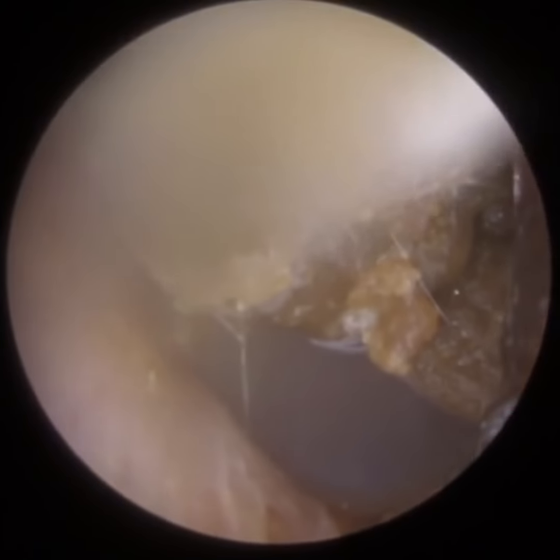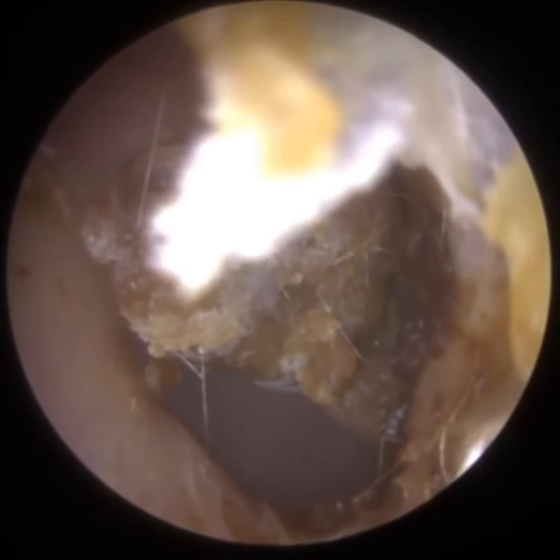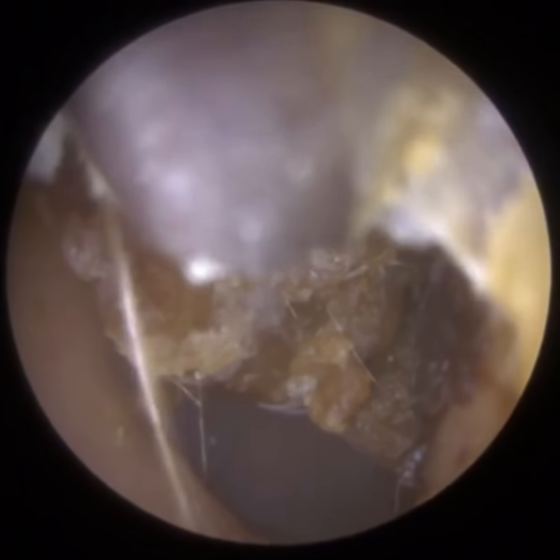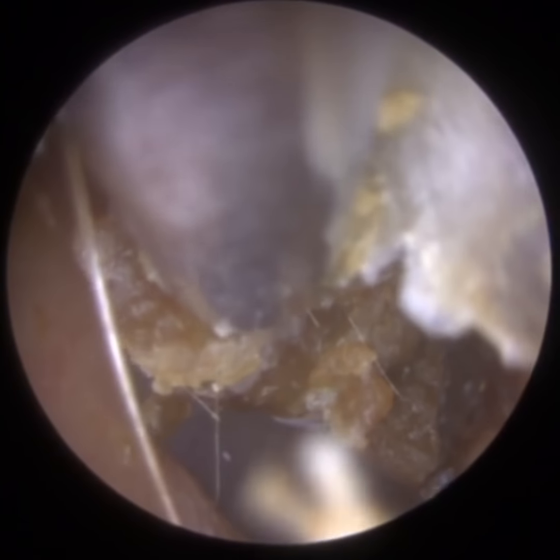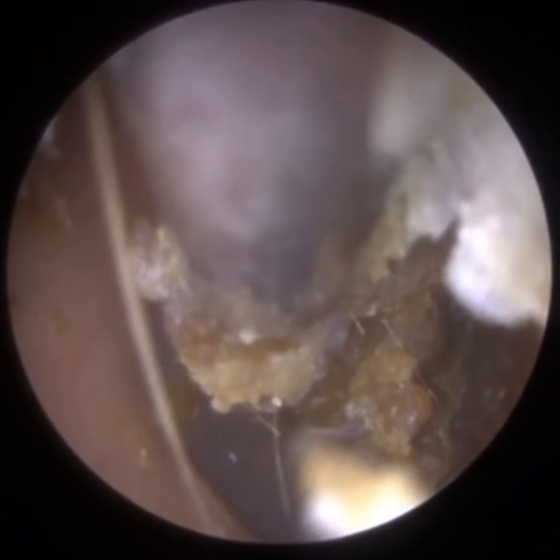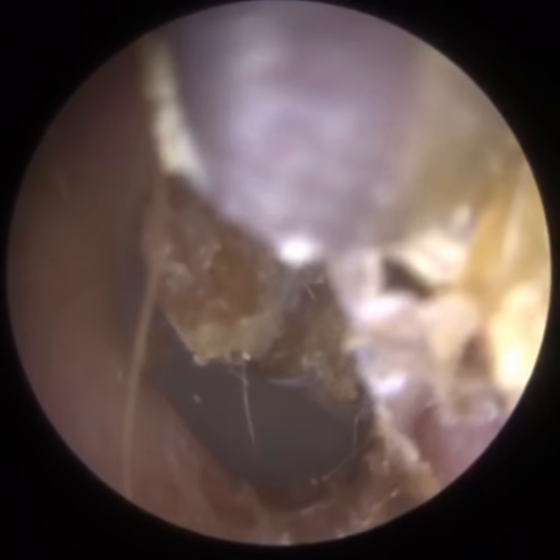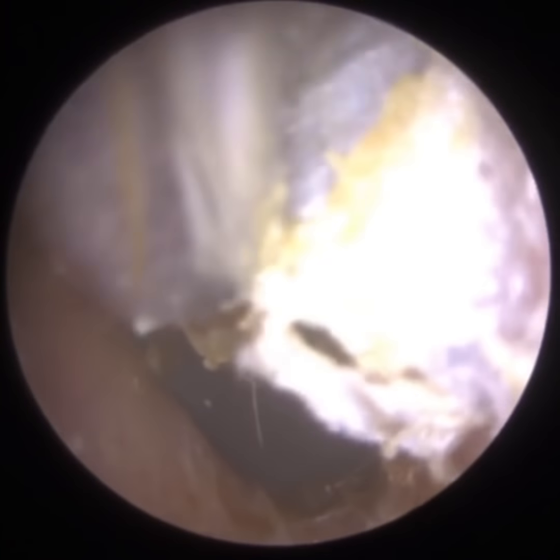So we can see we've removed the occlusion from the ear canal. In the distance there's that dead wax, dead skin, with fungal spores. You can see the white spores on there. Now, it was quite strongly adhered, this was. I tried to get a suction grip onto it, but it was lodged in the anterior recess. So what I'm going to have to do is elevate this dead skin, as you can see I'm doing now, on the anterior canal wall.